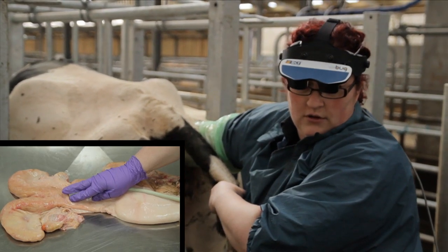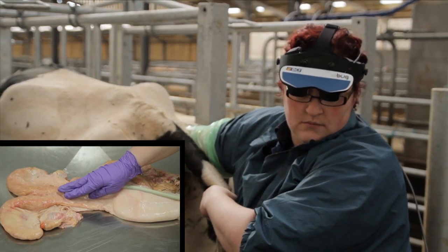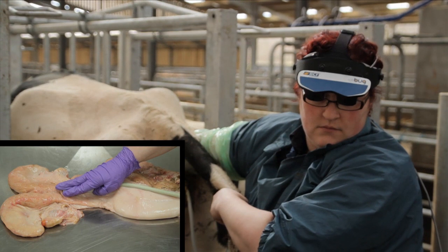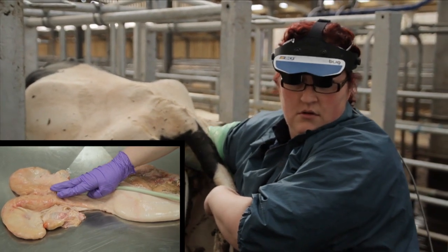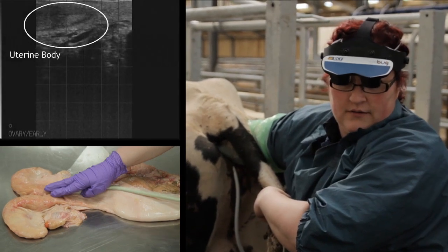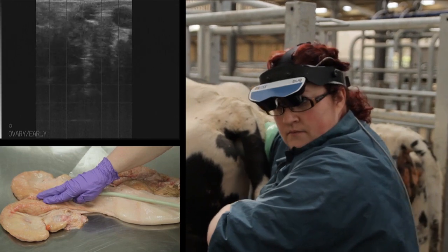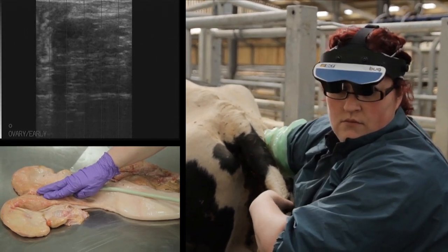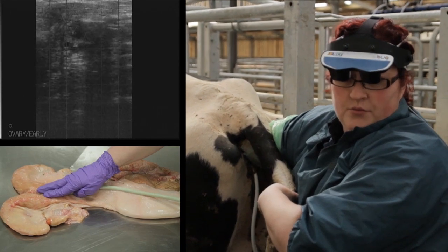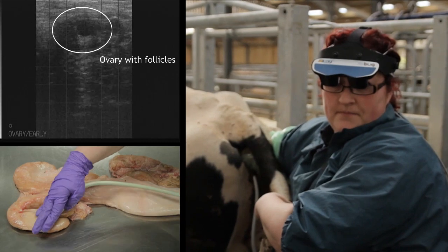Ensure you have good contact. Come to the body of the uterus. Travel up one uterine horn, up to the ovary.